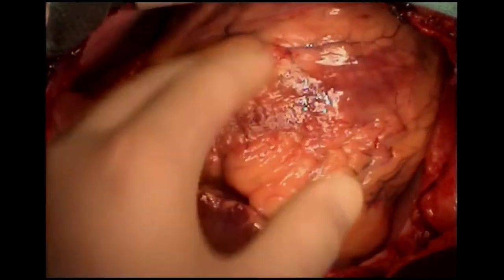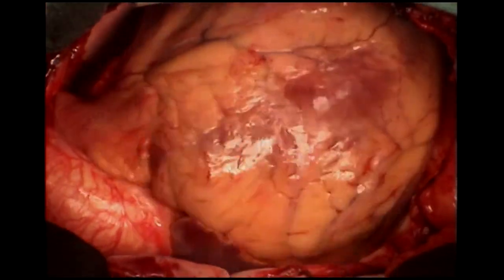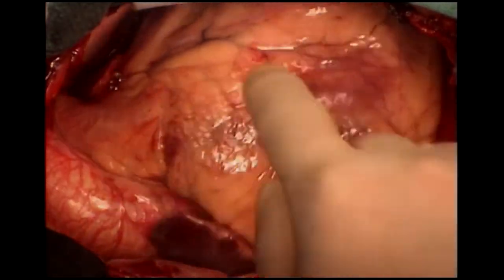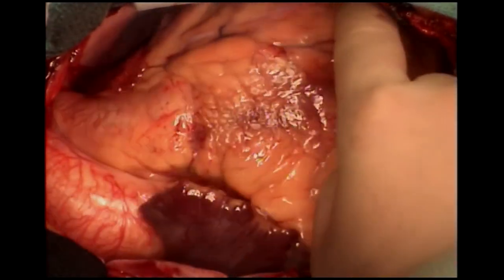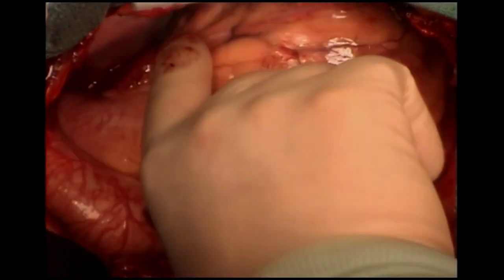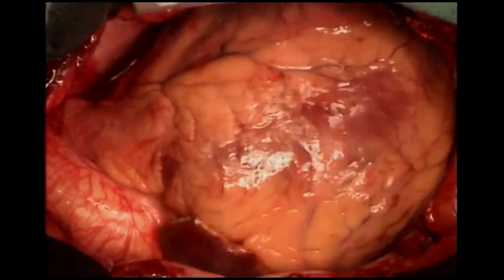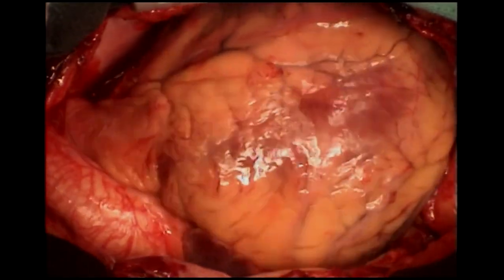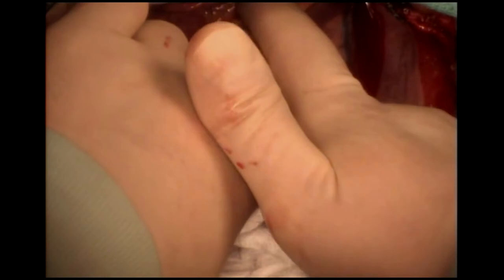You're looking at the front of the heart, and this is a lady who needs to have two bypasses done. One of them will be to the left anterior descending artery, which is the LAD on the front of the heart. The other one, to a vessel I'm pointing to here, the diagonal. The vessel going to the back of the heart, the circumflex, is okay, and the one going to the right side, the posterior descending artery, is simply too diseased to do anything with.